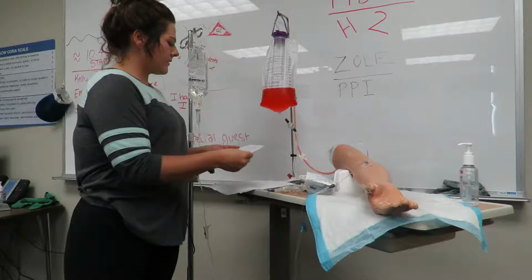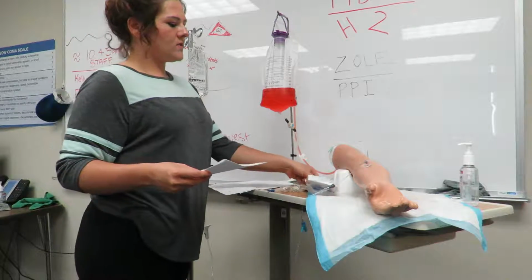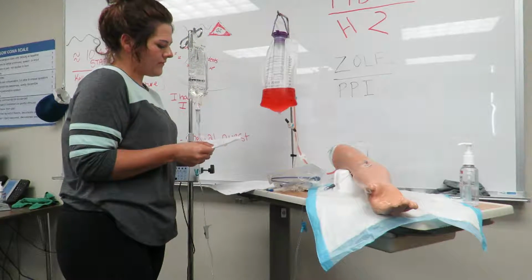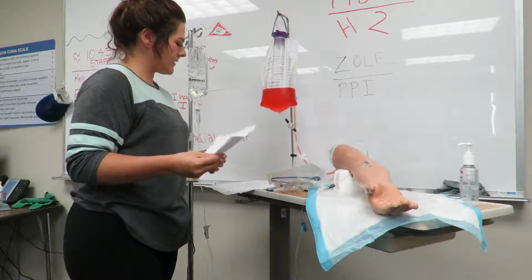And my calculation for today, we are going to be giving you 50 milliliters over 40 minutes. And my tubing calls for, it'll be administering 10 drops per milliliter. So we will be giving you 12.5 drops per minute. Yep, okay, that's my antibiotic.